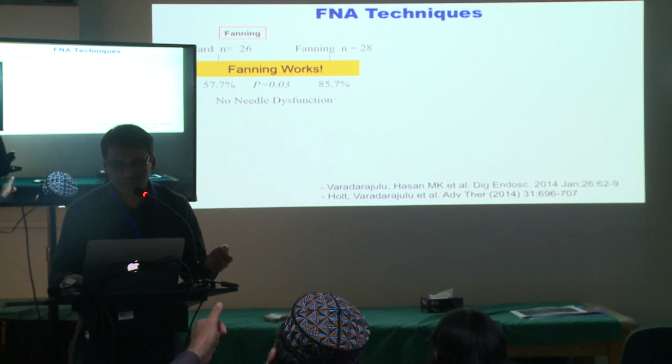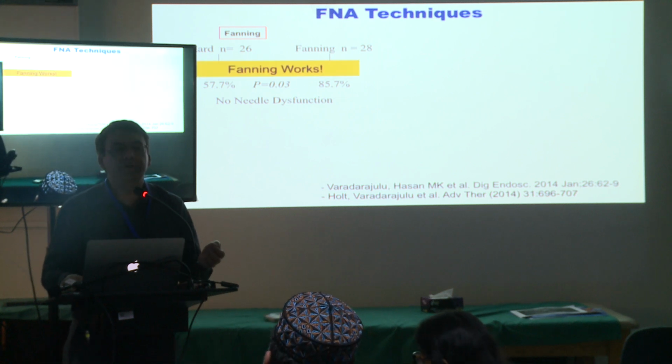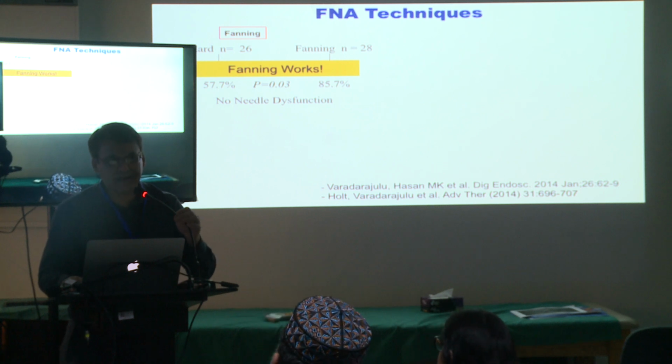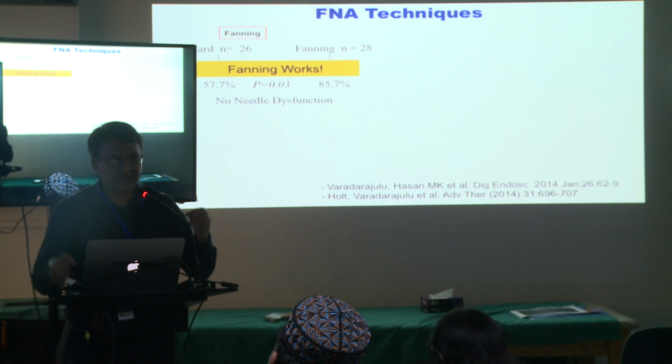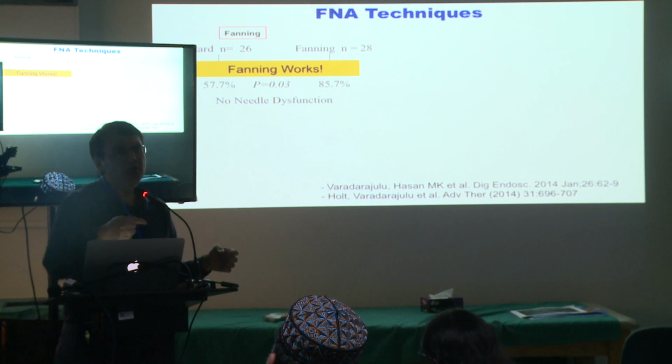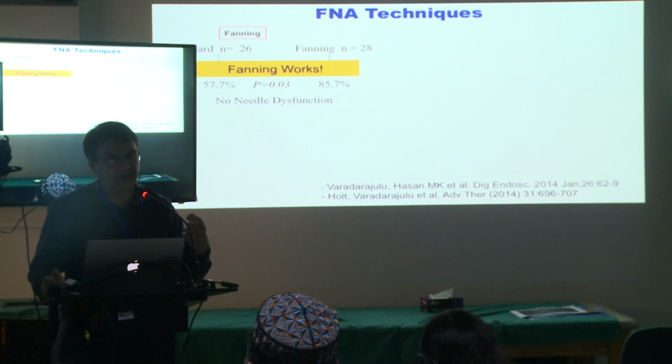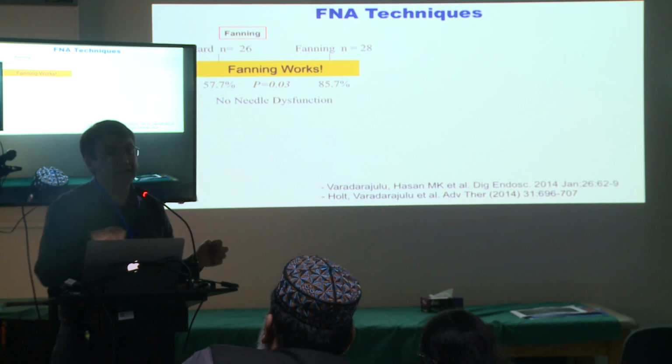If you use the elevator to change the direction, it will be difficult. Again, it depends on your position, but when you use the elevator, the needle goes like this, so it becomes a little difficult. So it's better to use the wheel if possible, or move the scope in and out.